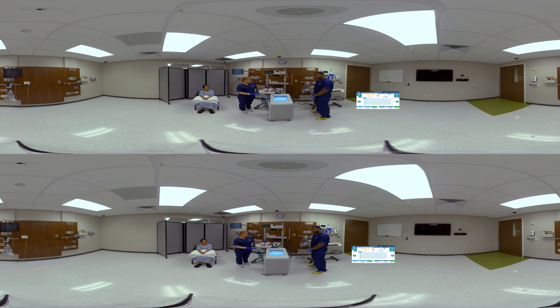Here on the main screen, you can verify that your device is programmed according to your hospital protocol at the bottom. Once you've verified your settings, you can simply click the green start button. Therapy started.